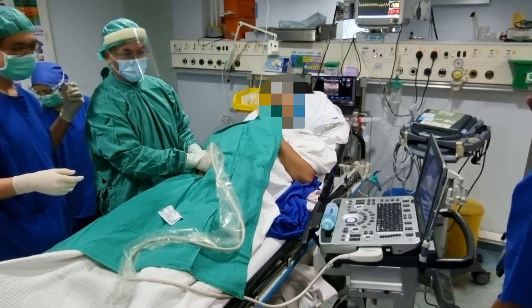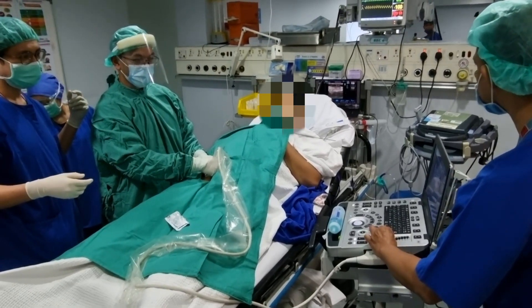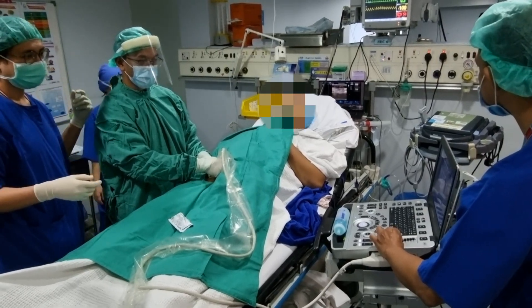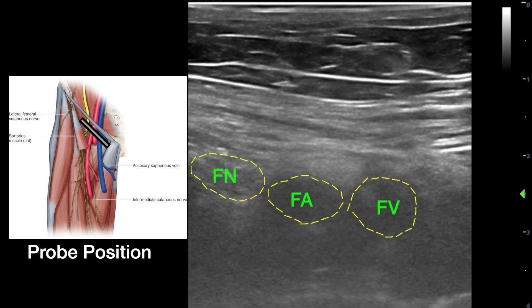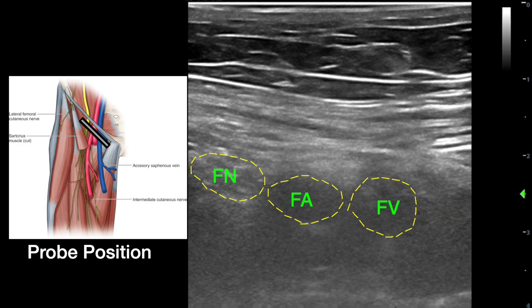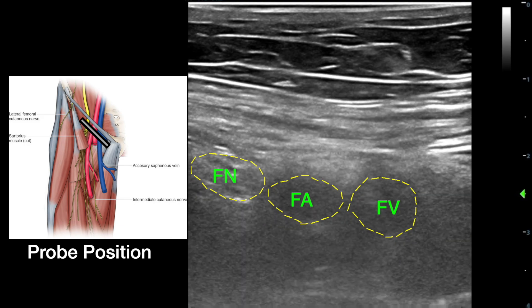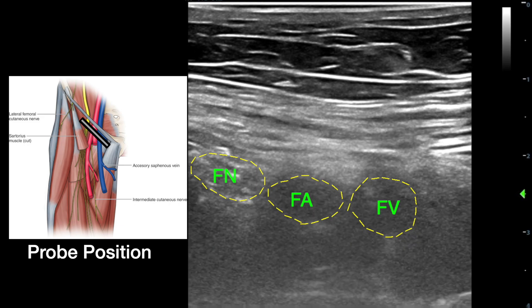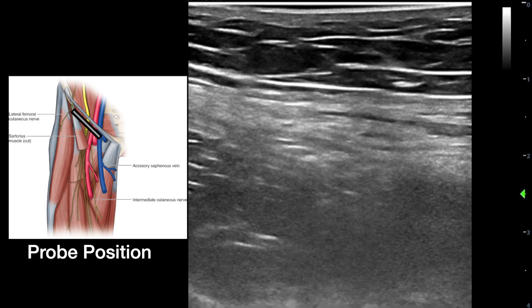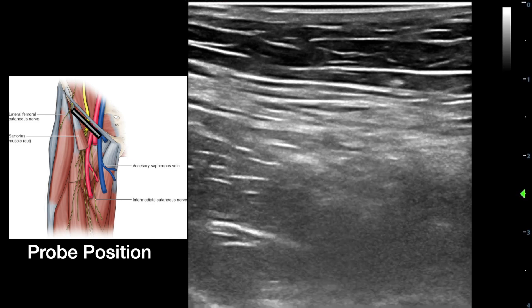To perform this block, the operator stands on the side to be blocked, with the ultrasound stationed across at the contralateral side of the patient. In this video, the probe is initially placed in the transverse position at the inguinal region to demonstrate the femoral vessels and the femoral nerve, similar to a femoral nerve block. The probe is then aligned supralaterally towards the anterior superior iliac spine.